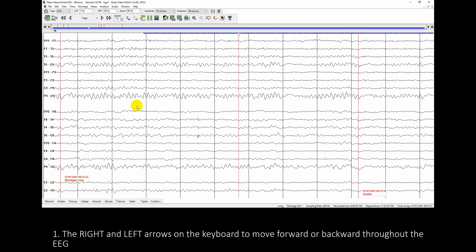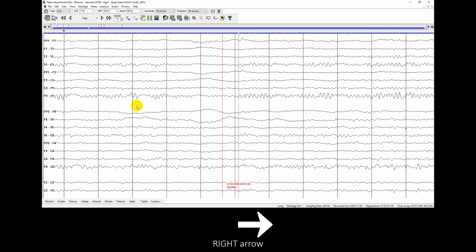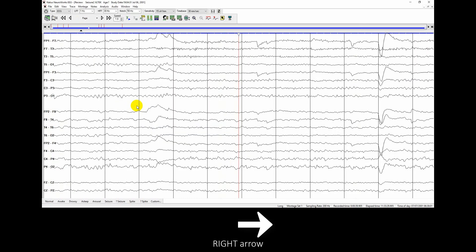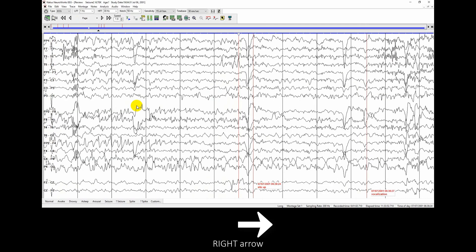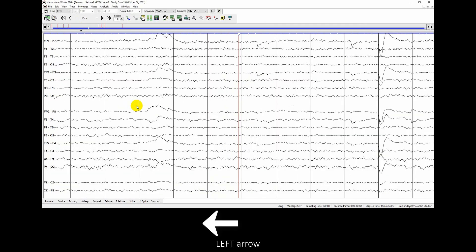Use the right and left arrows on the keyboard to move forward or backward throughout the EEG. Press the right arrow to move forward, and the left arrow to move backward.